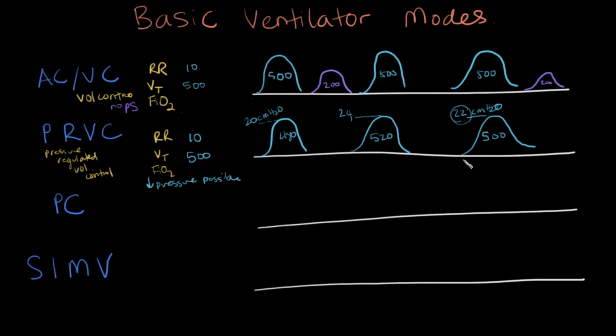And this is important because the patient's lung compliance, the respiratory mechanics that we discussed before, is going to be changing and hopefully improving. This ventilator mode will help to optimize the pressure support.